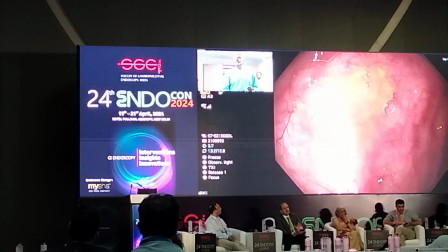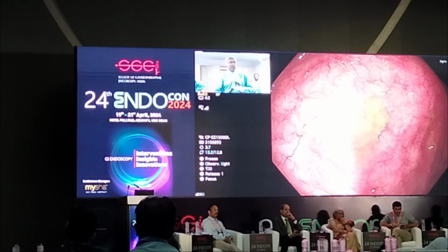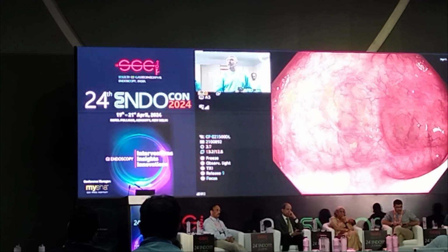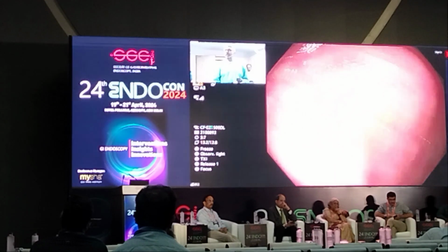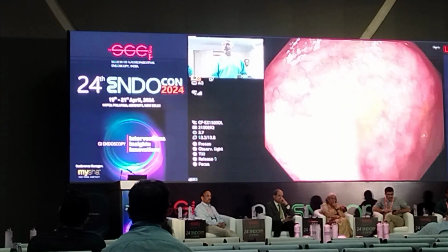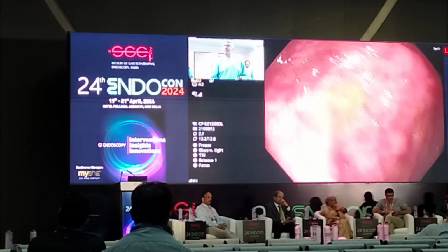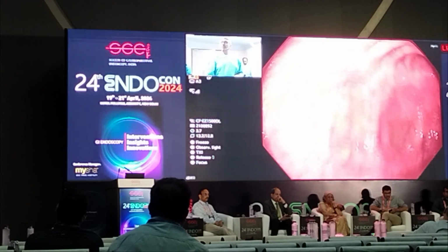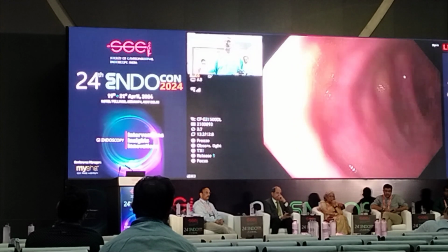And in these cases, the mucus cap obviously gives you a slight clue as to the presence of the SSA underlying that area. So I don't tend to wash the mucus cap off straight away, because until I'm ready to do the polypectomy, I'll keep the mucus cap there, because it's one thing that will help guide me as to where the lesion is. Often if you remove the mucus cap, then the lesion actually becomes very, very difficult to see.